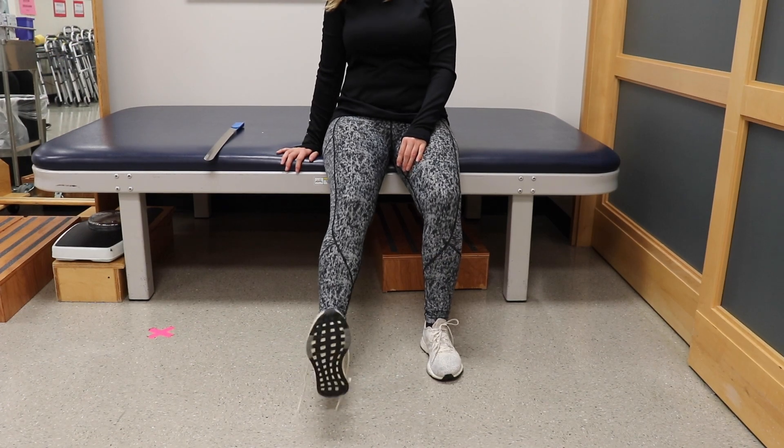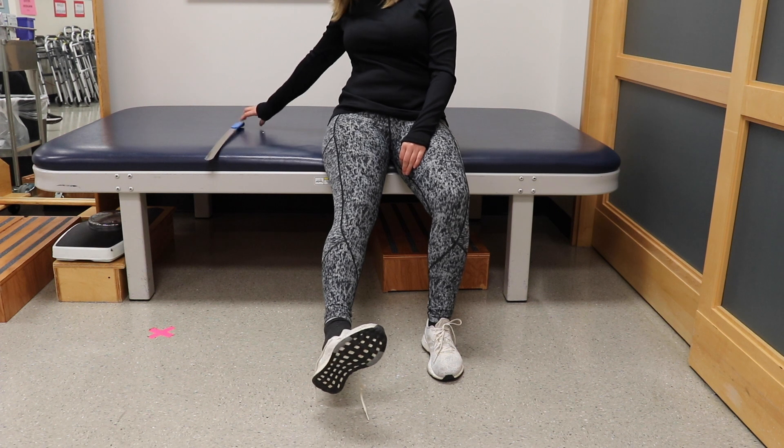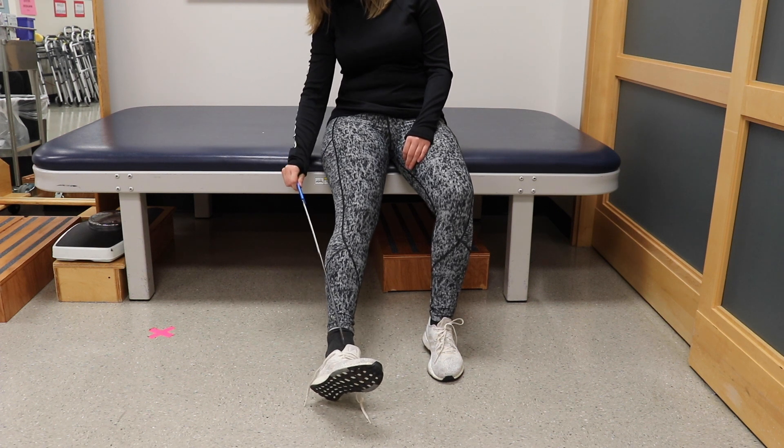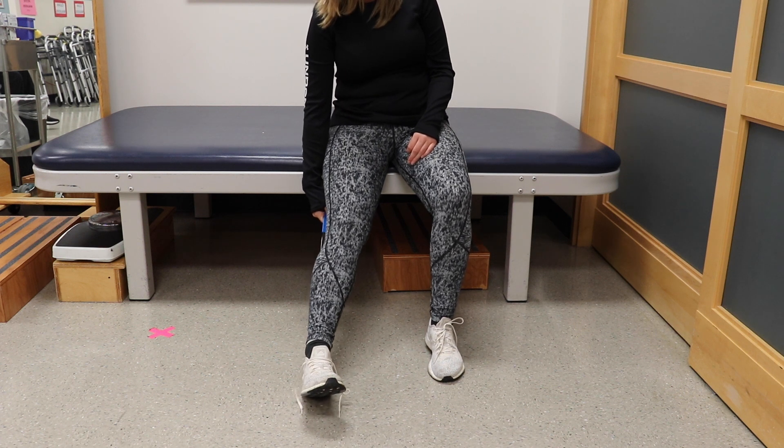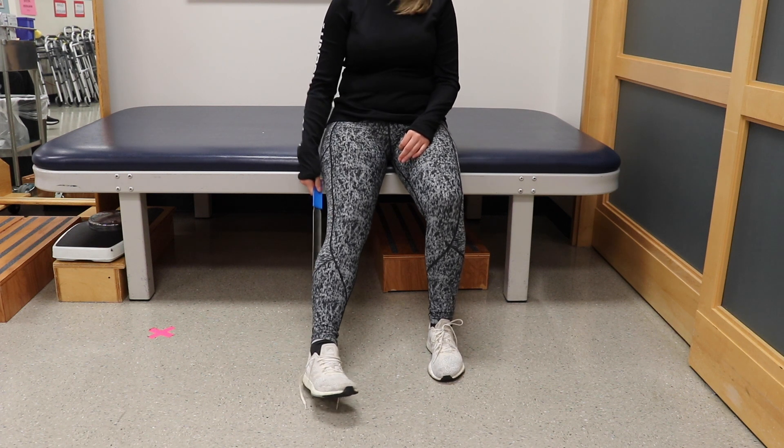Use a long handle shoe horn to help put on your shoe. Slide your foot into the shoe and rest the shoe horn at the back of your heel to help guide your foot into the shoe.